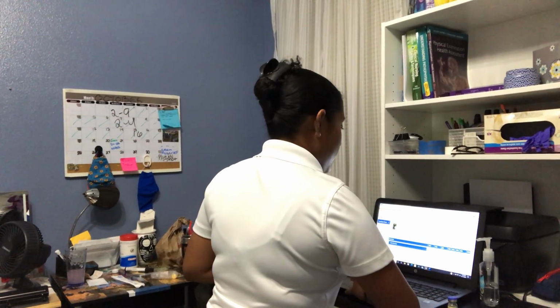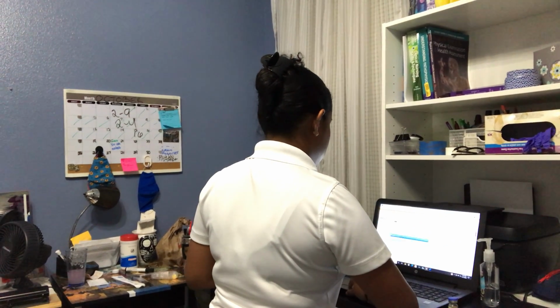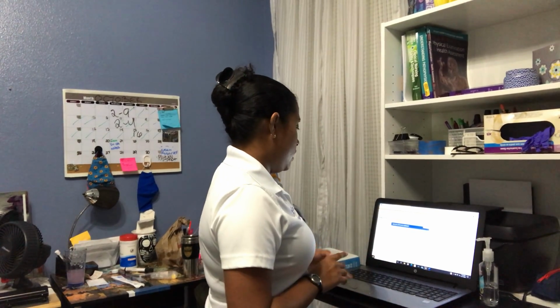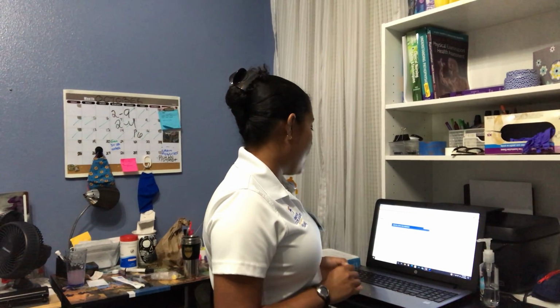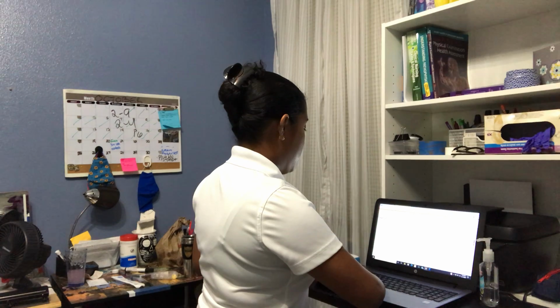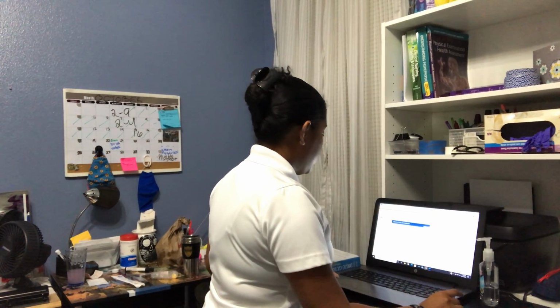Next, I'm going to do the patient's 5 rights. First, the patient is Oscar Simpson. Next is the medication, which is the medium dose insulin lispro. Okay, the dose and frequency is before meals and at bedtime, and based on his 200 glucose level, the patient needs 4 units of insulin, and its route is subcutaneous.